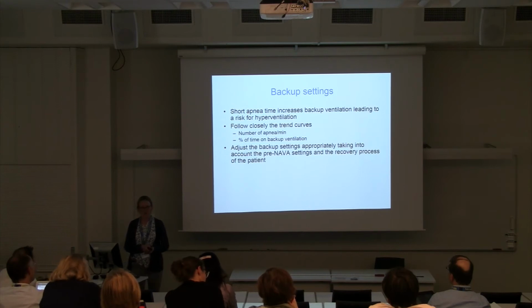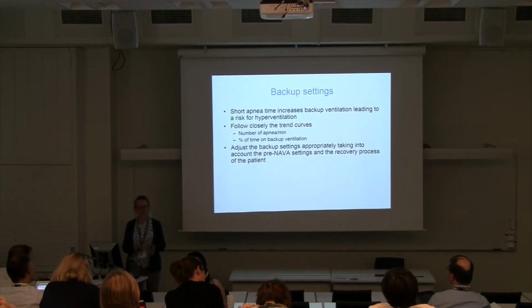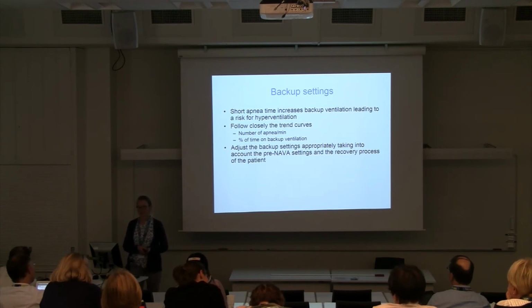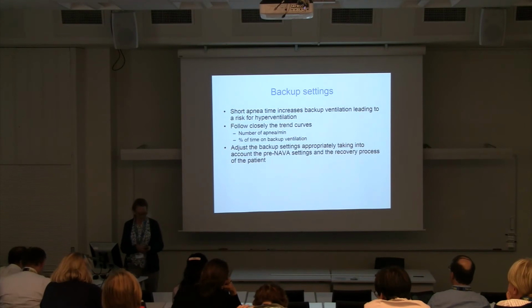And after switching to NAVA, we have to follow the trend curves very closely: how many apneas per minute the baby has, and the percentage of time on backup ventilation. And then these values, the apnea time and the backup settings, need to be adjusted.